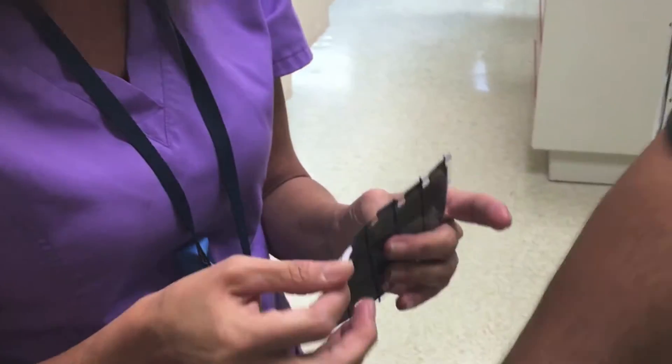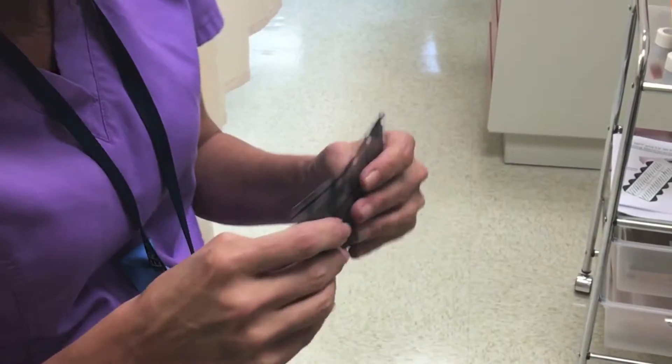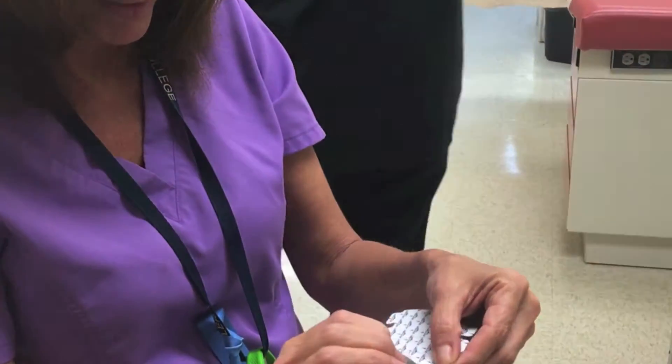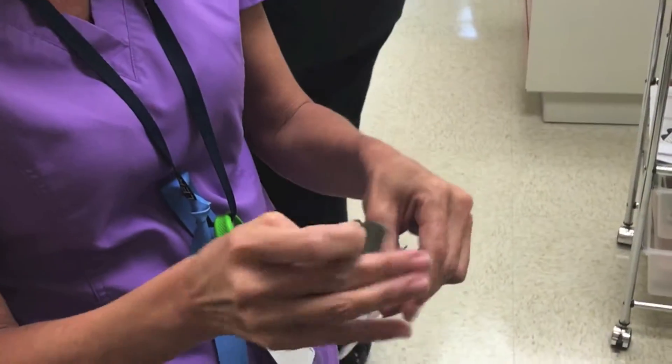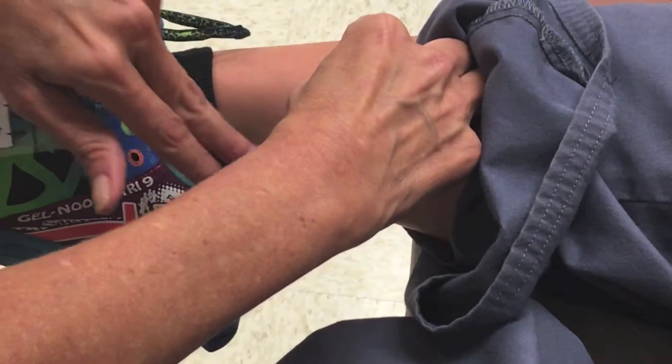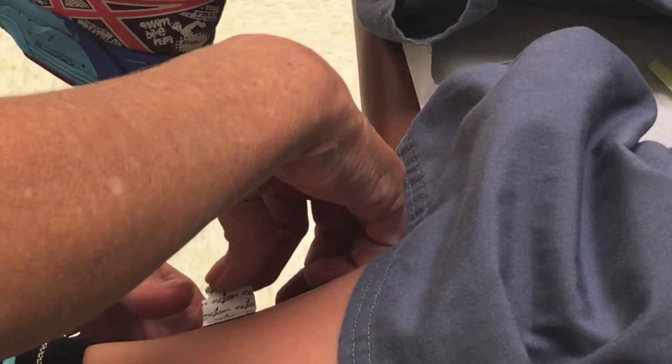These are the electrode tabs — they're sticky, and the machine will attach to these and give the readings for the EKG. You always want to place the tab grabbing towards the machine to get an accurate reading. You want to get on the inside, the meaty part.